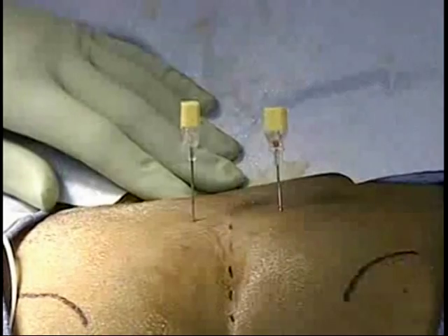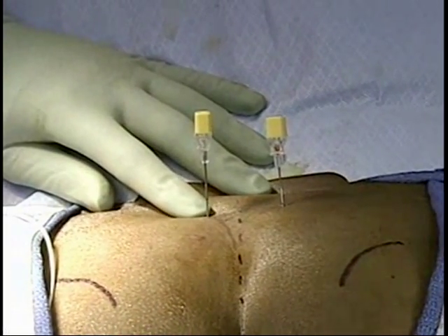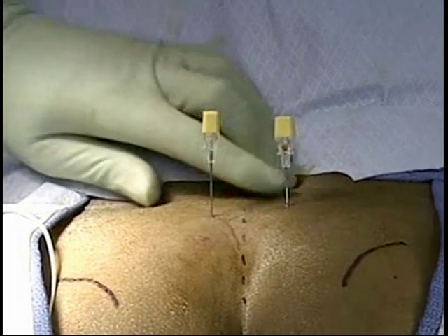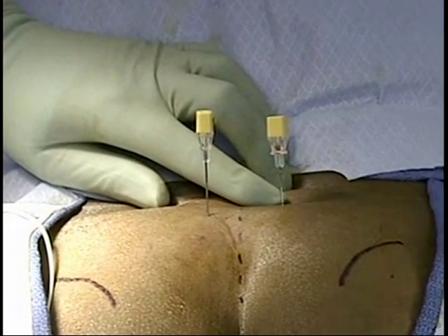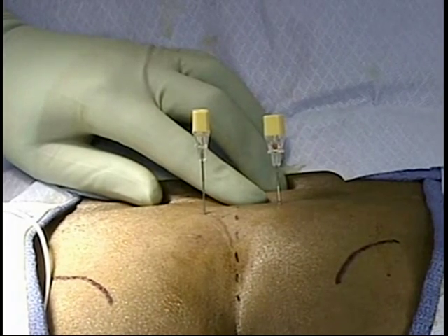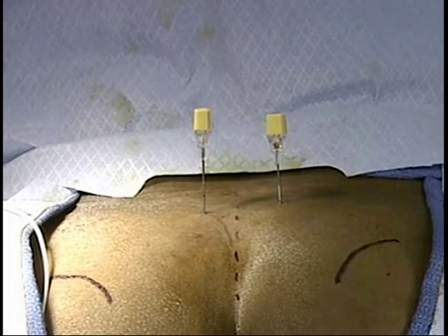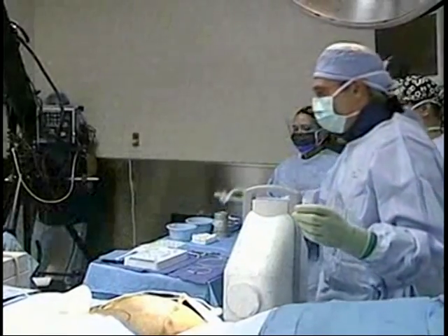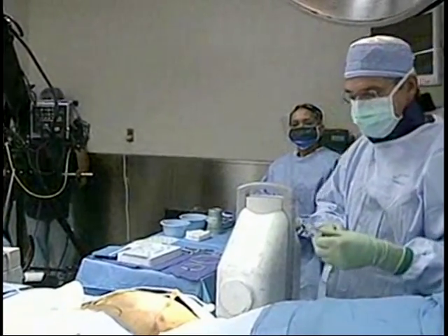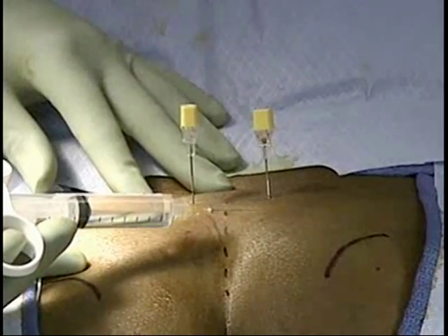I really have two choices at this point: I can place simply the left wire into the S3 foramen, or I can introduce a wire into the right, or I can see whether I can get a response from the S4 on that side. Because in truth, we can get benefit not just with the S3 foramen but also the S4 foramen. So I'm going to numb him up a little bit on that side.